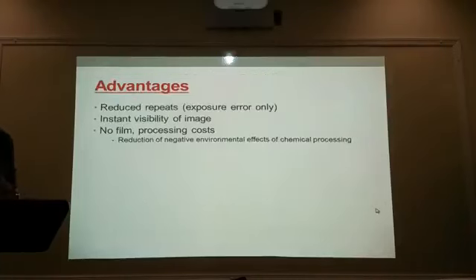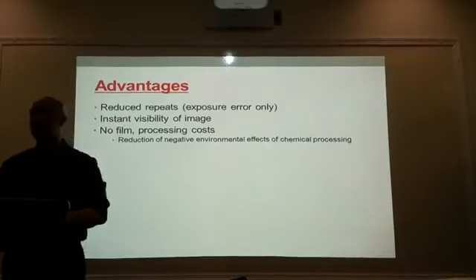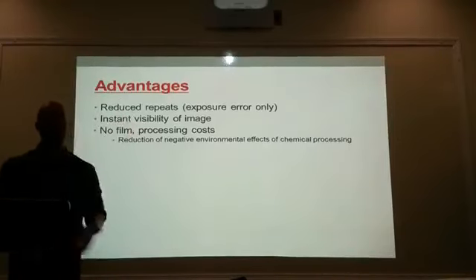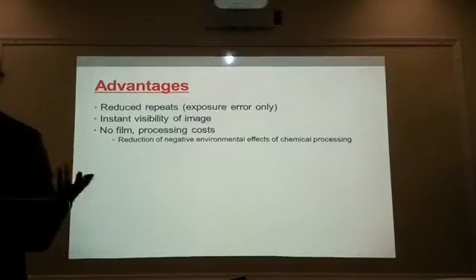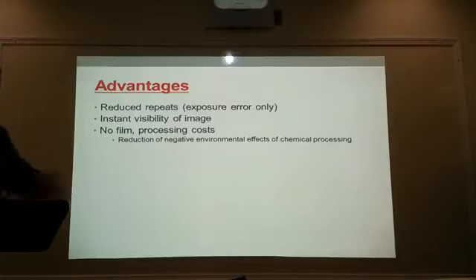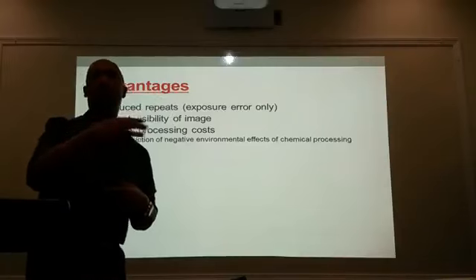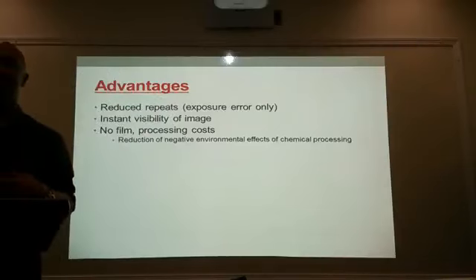Also, the advantage is, as you saw with the previous slide, you can't have repeats based on your poor decision in selecting your technical factors anymore. Whatever you use, your image is always going to come out good. Okay? So it eliminates the exposure errors. But it doesn't eliminate things like poor positioning or the patient moving. Okay, we can't eliminate those.